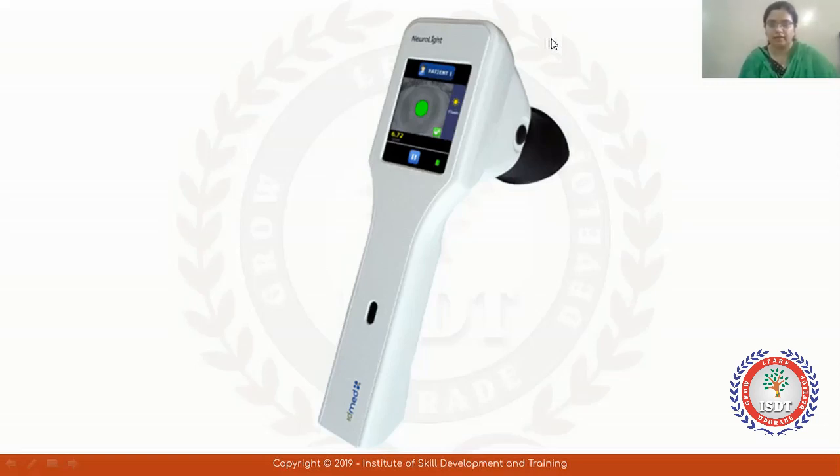Today we have put this instrument on the screen. What is this instrument? Does anyone know? If you want to know more about this, you can see my video. Many people say that it is like an AR, handheld AR, or handheld slit lamp — but this is actually a handheld pupillometer.